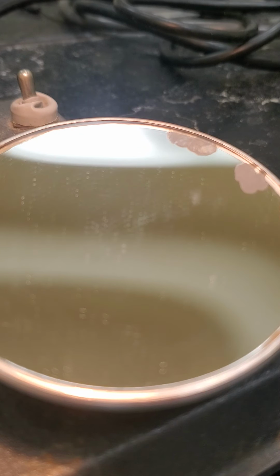So now I'm going to spin the rest of our tubes. So let's see, 10 through 14. So I'm spinning the remaining tubes for 15 seconds.